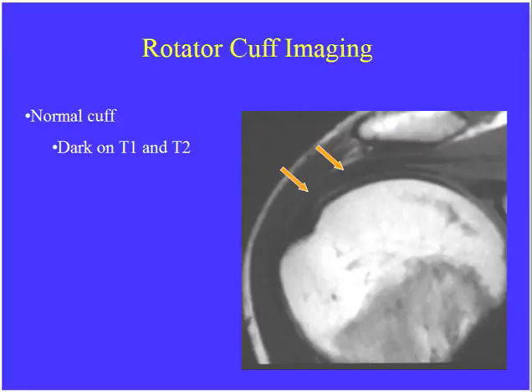So that pretty much covers the labrum and the things they might ask. They're either going to show you a Bankart or reverse Bankart, possibly a Hill-Sachs lesion, and want you to be able to distinguish between anterior and posterior dislocation.